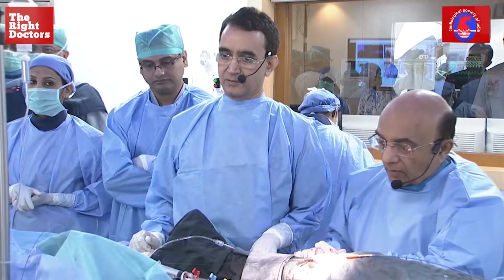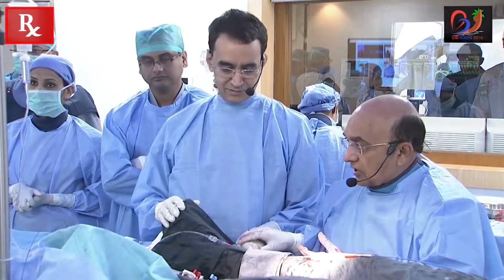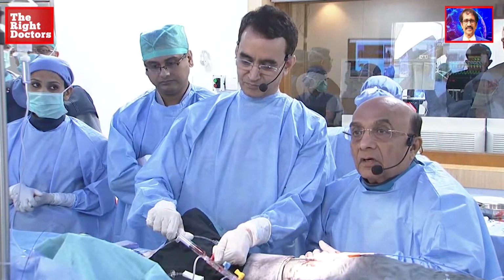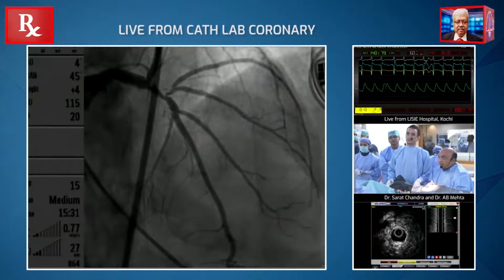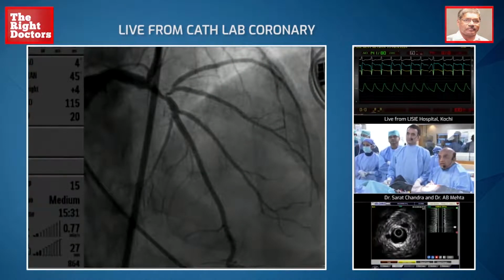Okay, now I have with me Dr. Sharat Chandra, and he needs no introduction. And now, what we have here is this lady whose history you just heard. This lady has a complex bifurcation lesion between the LAD and a diagonal.